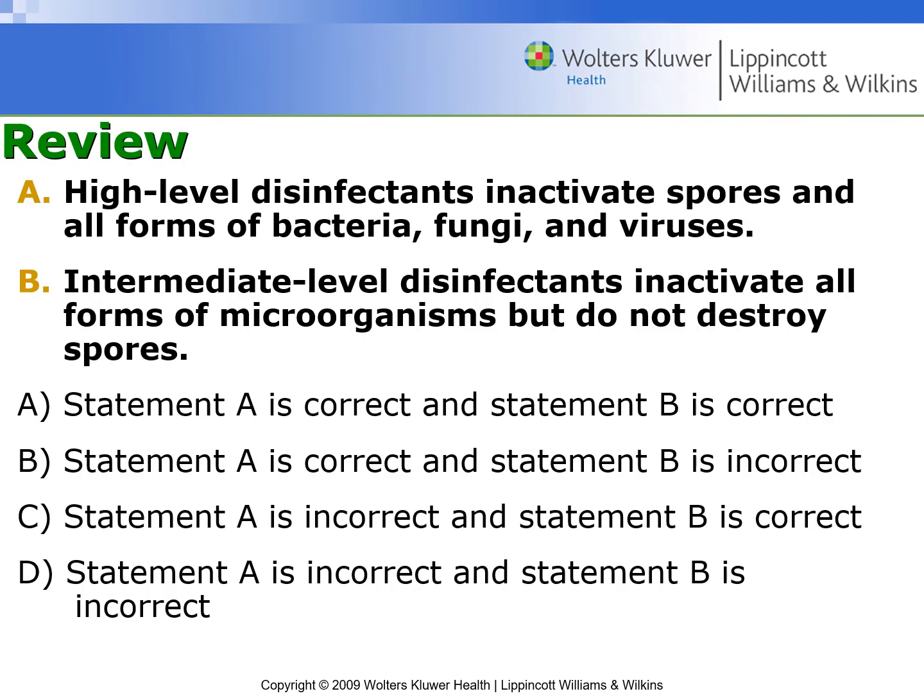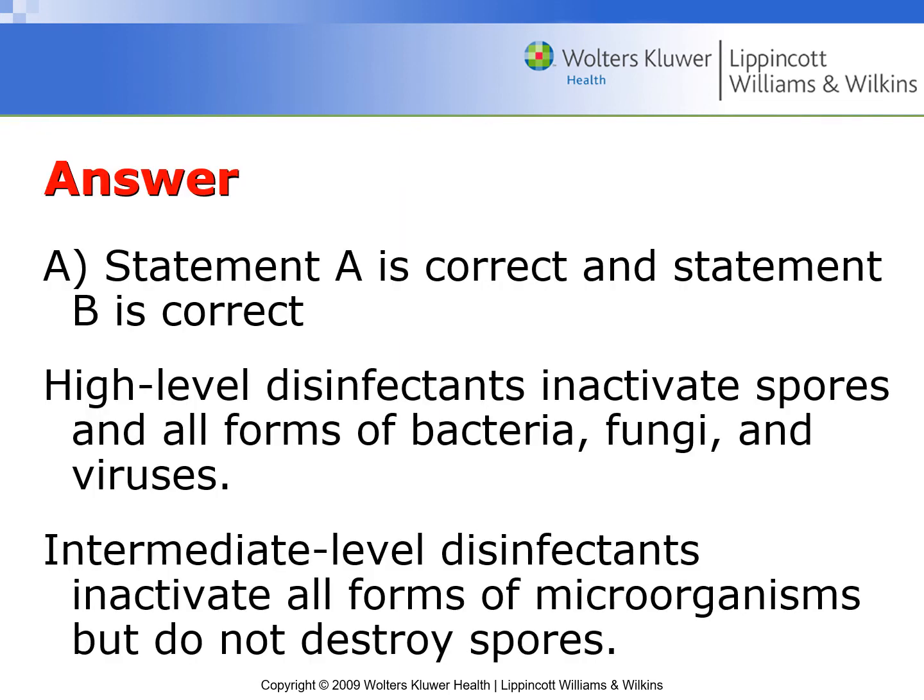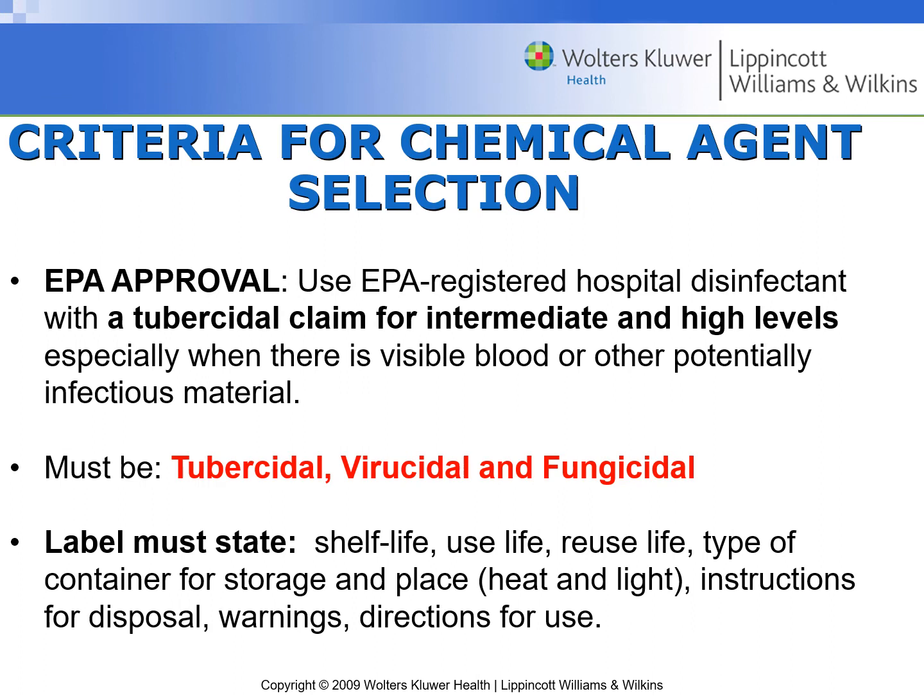So here are some questions on the review about which statements are correct and incorrect. I will let you go through. I'm sure that there'll be at least one question on boards about this, and they could ask about any of those. You need to know what high, intermediate, and low level disinfectants can destroy and what they can't.